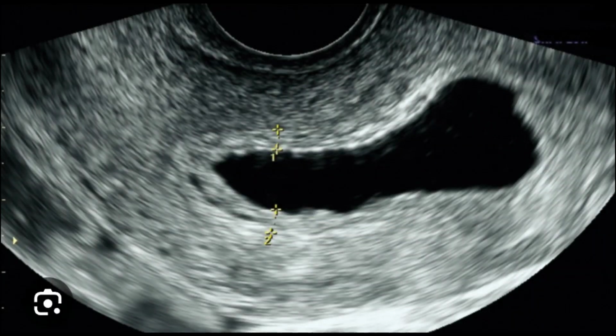So specific features for the pelvic inflammatory disease have already been discussed. Now we are coming to the point where some non-specific features may also lead to pelvic inflammatory disease on the basis of ultrasonography. This is again a transvaginal scan, and on this transvaginal scan you can appreciate the uterus is visible, and within the uterus it is quite clear that there is a distended, fluid filled endometrial cavity.